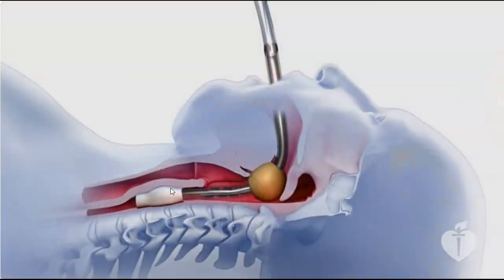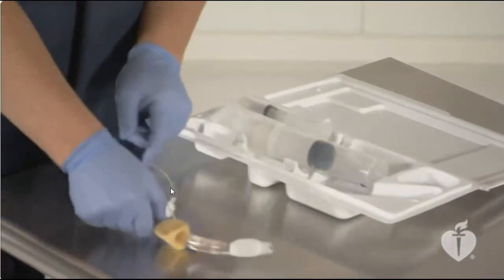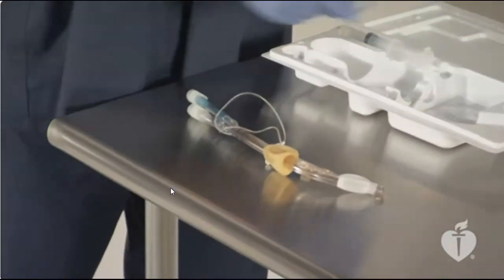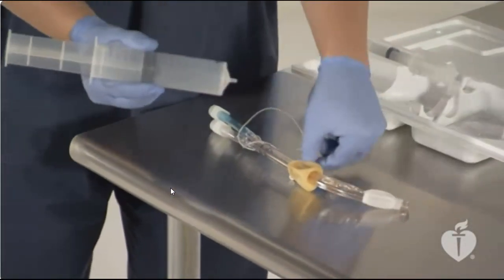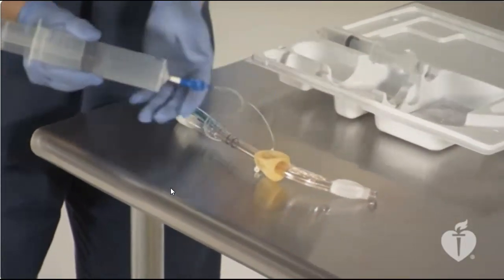If the tube rests in the esophagus, which happens most frequently, the cuff blocks the esophagus and air flows through opening number 1. If the tube comes to rest in the trachea, however, the provider can use opening number 2 to deliver ventilation without having to reinsert the device. The esophageal tracheal tube comes in 2 sizes. A 37 French is used in patients who are 4 to 5.5 feet tall. A larger tube, a 41 French, is used in patients more than 5 feet tall.